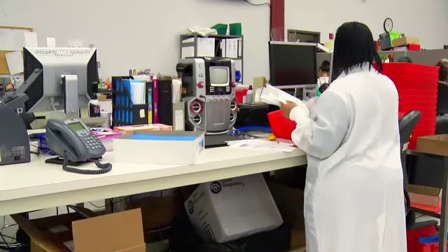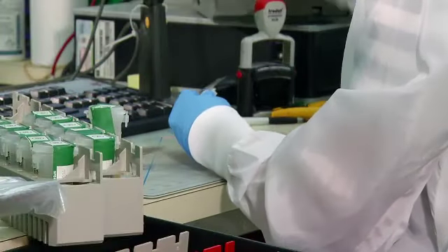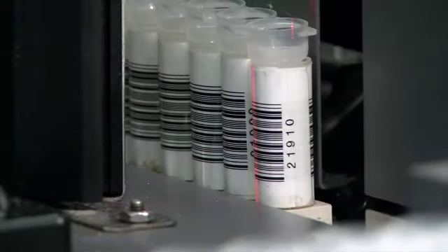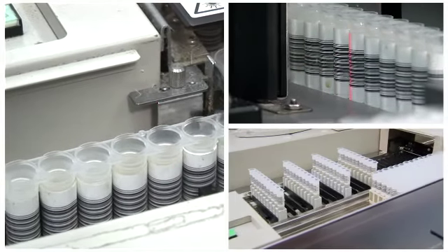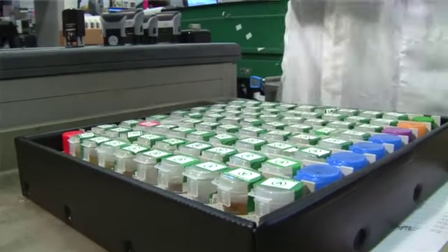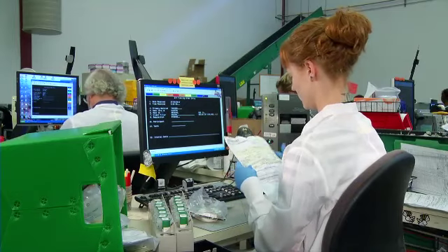The external chain of custody documents supplied by Quest Diagnostics to the client contain a unique client and specimen identification number that is included on the final test report. There is also a unique lab accession number assigned, which is used for tracking the sample throughout the testing and reporting process. Each chain of custody form contains a tamper-evident security seal on the specimen container, which is pre-printed with the same number as the form.